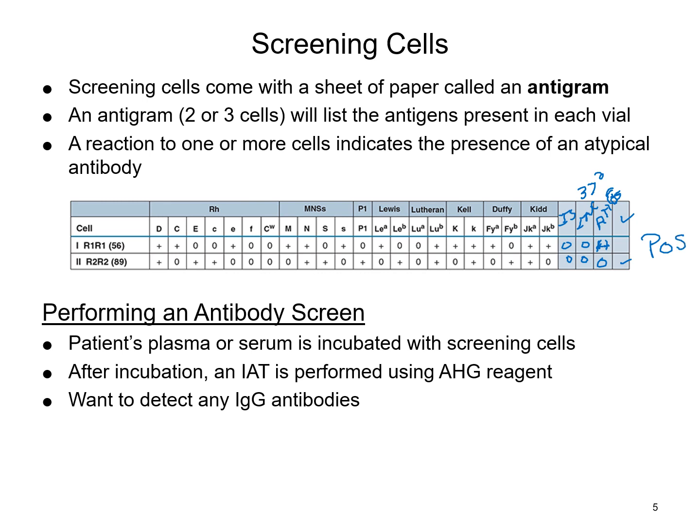So it doesn't really matter where in this whole process that this reaction happens, as long as you have some sort of reaction. So you could have one reaction here or one reaction here. Doesn't really matter. If there's a positive reaction at any point, now this does not include your check cells. Remember, this is a validation, so we're not going to include our check cells.